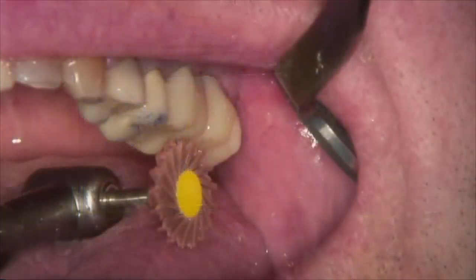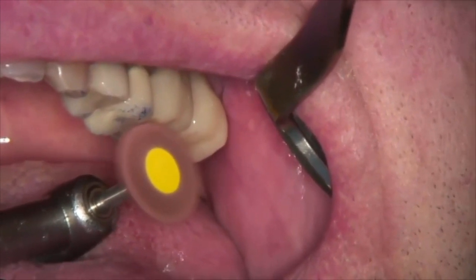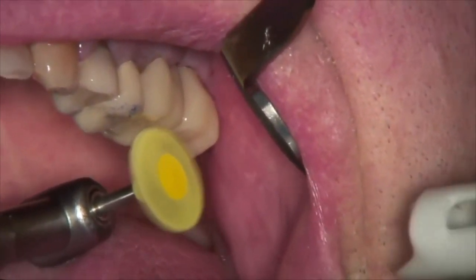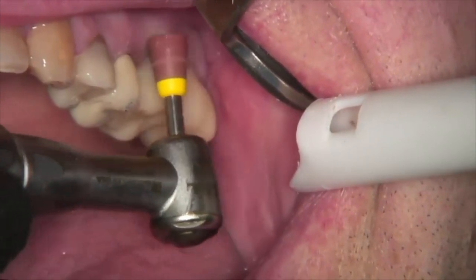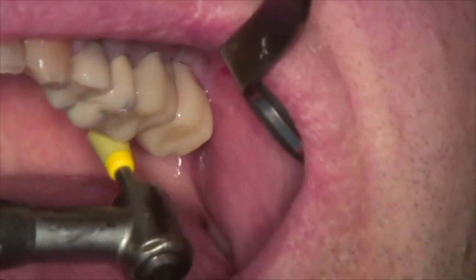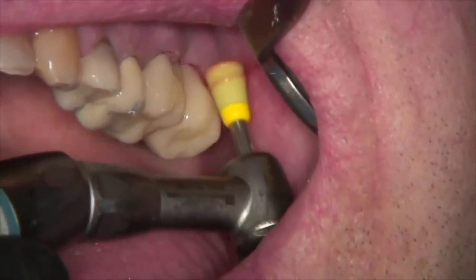The medium and fine Featherlight polishers are used to polish the areas adjusted on the occlusion. When polishing intraorally, little to no water is recommended. A speed of 6,000 RPMs is used for the medium polishers and 4,000 RPMs for the fine. The medium and fine Dialite cups are best used for the cervical one-third of the restorations, again at 6,000 RPMs for medium and 4,000 RPMs for fine.